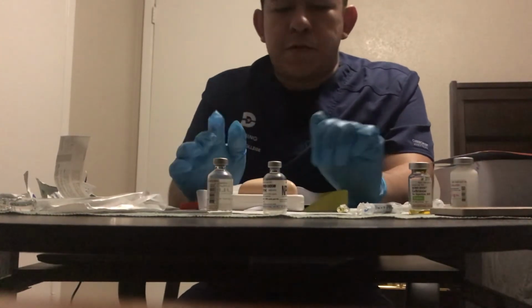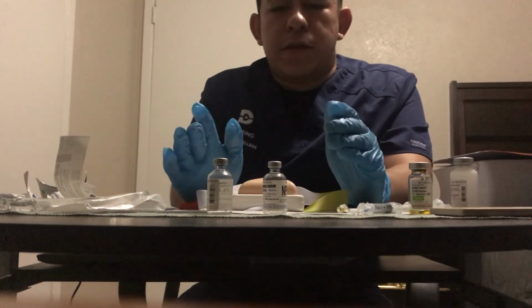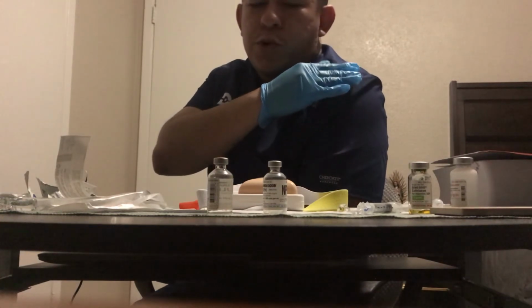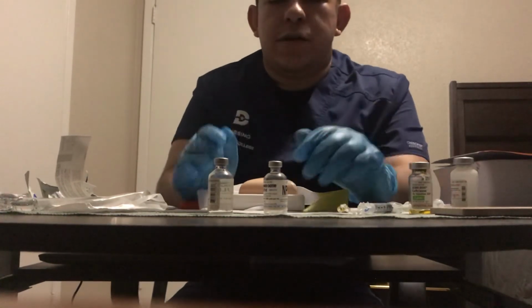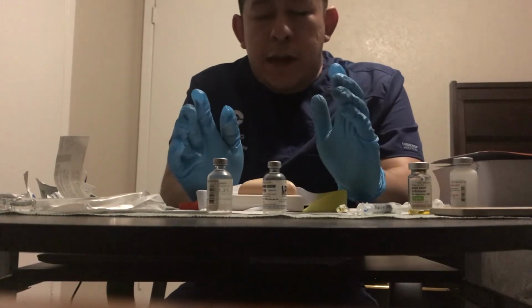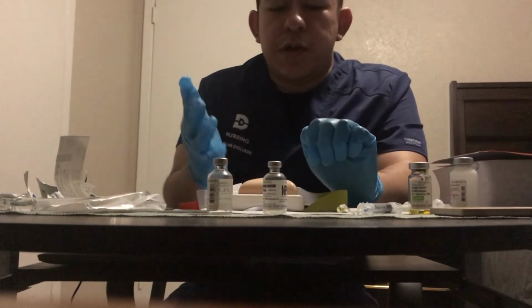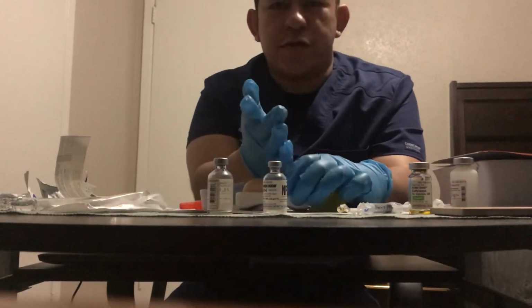And then lastly we have our IM injection. Now IMs are best given in the vastus lateralis or also in the deltoid. So for the deltoid you find the acromion process, and then you go 2 to 3 inches below that and you would insert it at a 90-degree angle. And you would use the Z-track method, although whenever you're at clinical, you do it per hospital policy. So for this demonstration, I will show the Z-track method, but I would first check the hospital policy, and if they don't specify, then I would use the Z-track method.